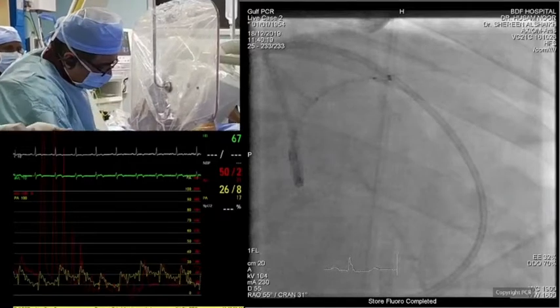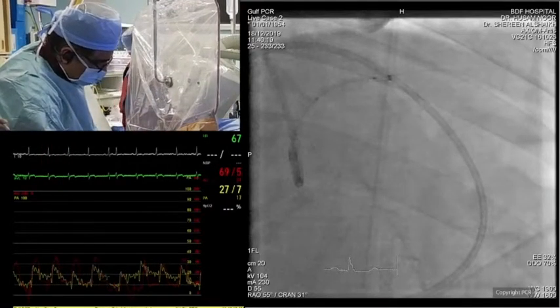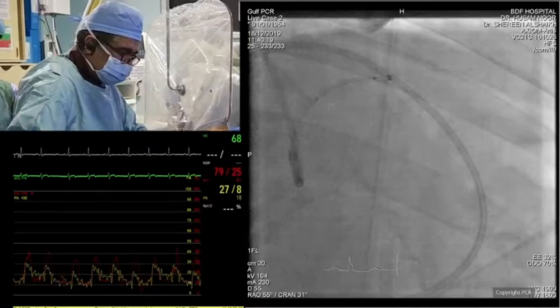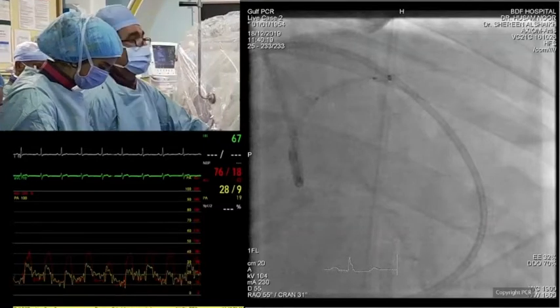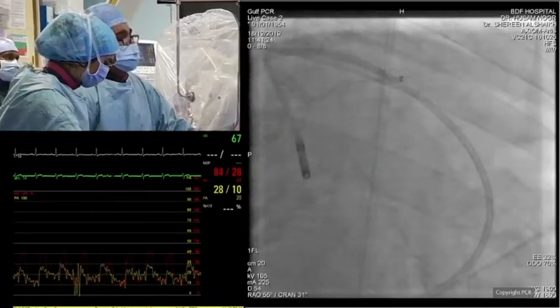Can you change the guiding in such cases into a left Amplatz catheter? I know it's very crucial. I think it's XB 3.5, but there is good angulation here. So he needs something to jump into the LAD. So maybe left Amplatz, the arch is big. The angulation is actually in the proximal LAD. That's giving the problem. It's not the ostial. Or he used a parallel wire now.